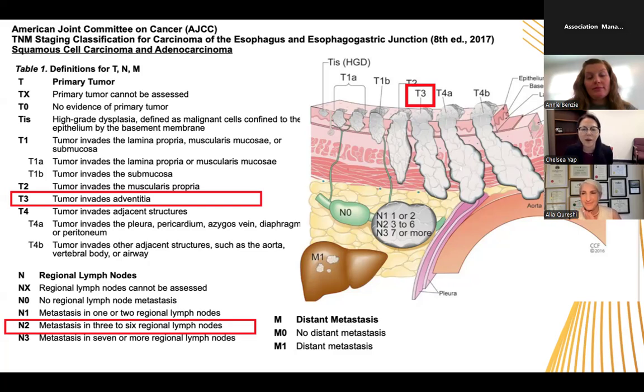Very interesting. Would that be anytime you're doing a preoperative J-tube, you would just use the J-tube surgery for the preconditioning, or sometimes conditioning without a J-tube? Yeah, great question. It's very selective. As you know, not every patient needs a J-tube. So sometimes for a smoker or diabetic, I will often do gastric preconditioning, or in other patients who are not so healthy or very frail and you're worried about perfusion. You can do it at any time. It has to be at least 2 weeks before the actual esophagectomy. So it's selective.